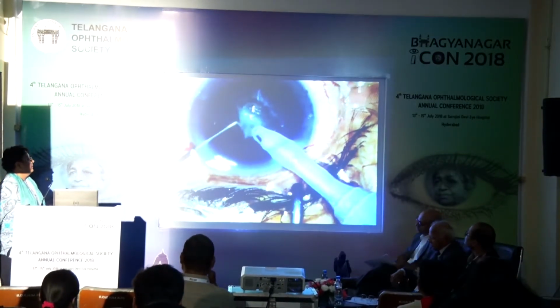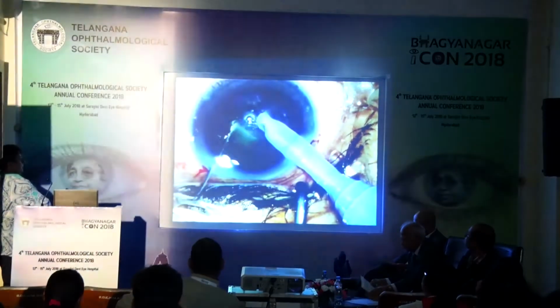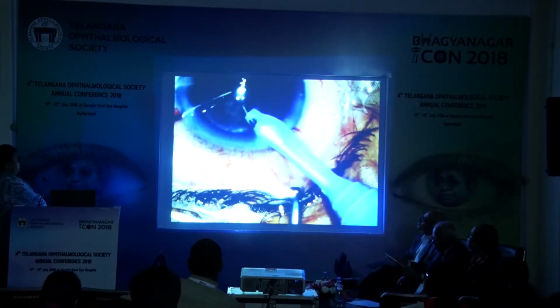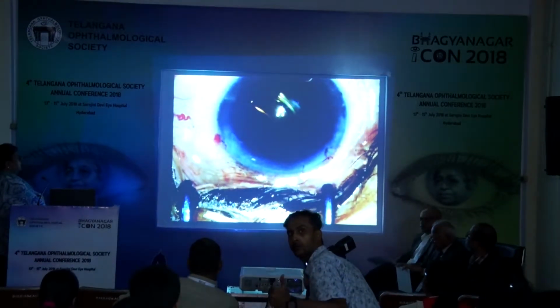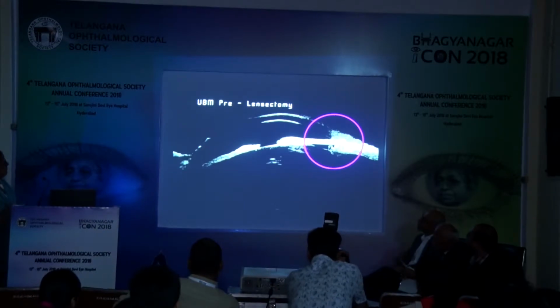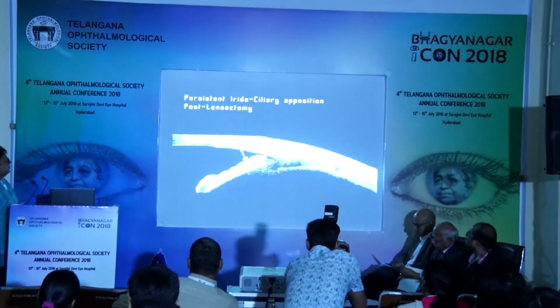Recent evidence from the EAGLE study suggests that lens extraction alone may be sufficient for control of angle closure disease. However, angle closure exists in various forms, and phacoemulsification alone does not seem to resolve the pure plateau mechanism of angle closure due to high ciliary body insertion.